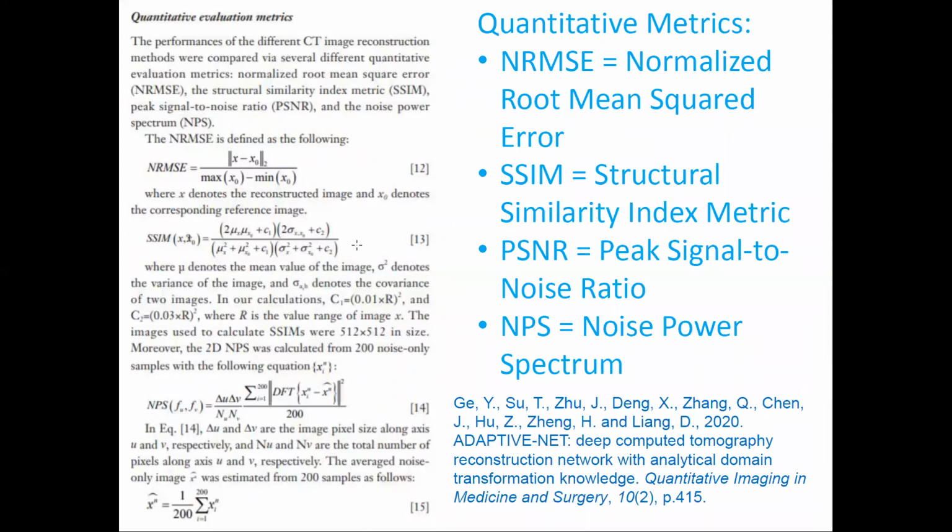Okay, nowadays in 2020, you have additional measures of your imaging system performance. And if you have known truth, or if you're comparing, the noise power spectrum is your classic measure from linear systems theory for signal to noise. So back when you had linear systems, like with filtered back projection, it had a direct meaning, and it is still defined the same way.